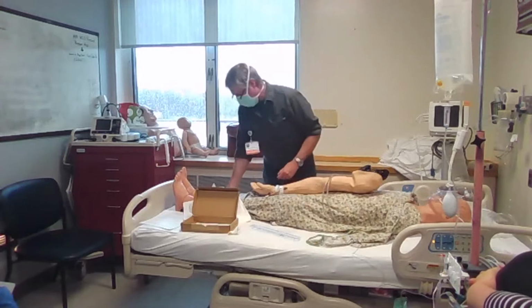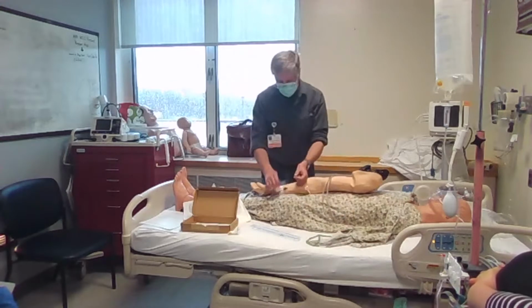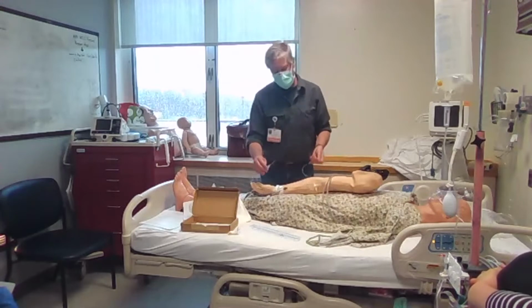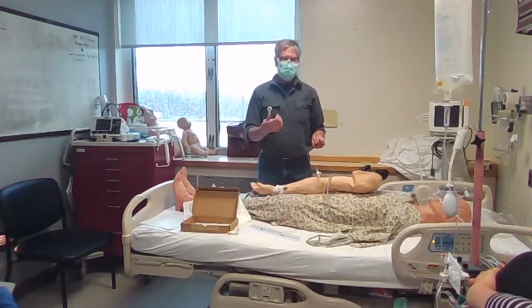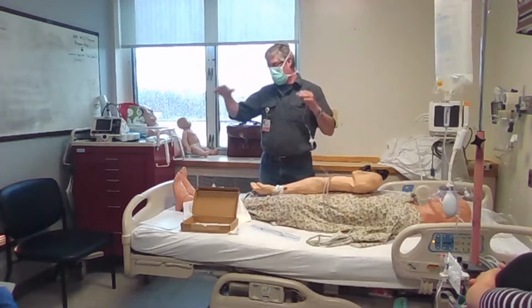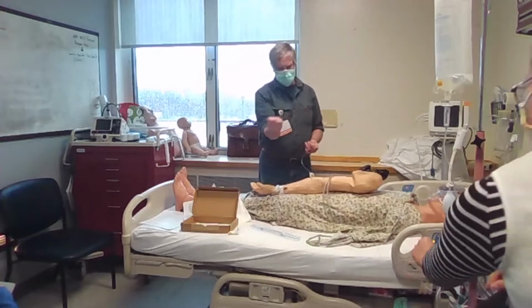So if the catheter is in the arm, and you got it all set up, and things aren't working right, the first thing I do is flush it. Because I flush them like crazy in the case, just because I don't want them to clot off. So you just flush it. If the waveform starts to look smaller or more damped or flatter, flush it.